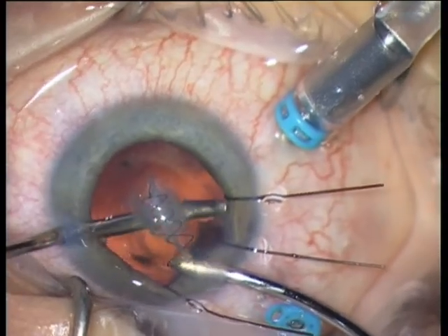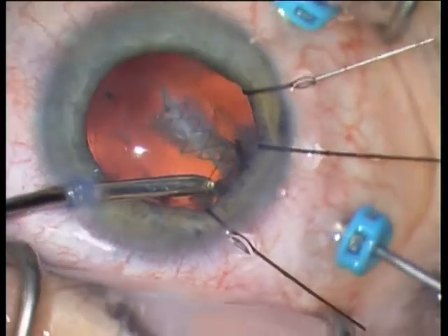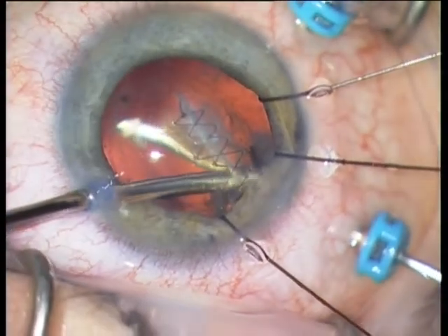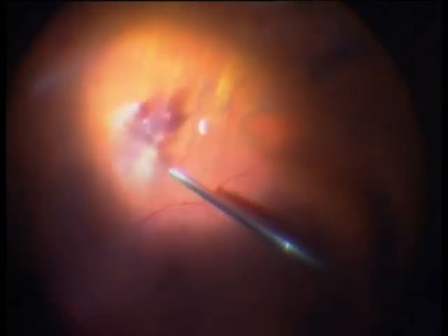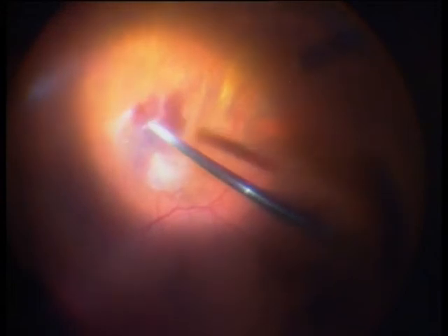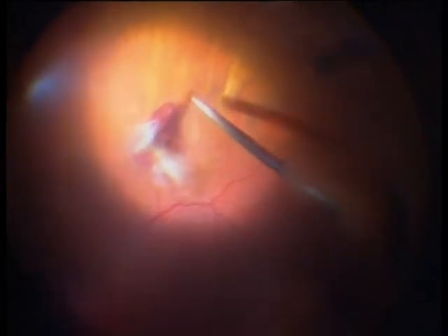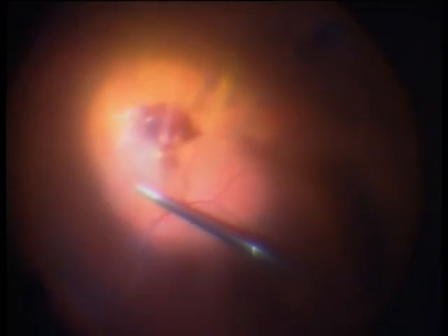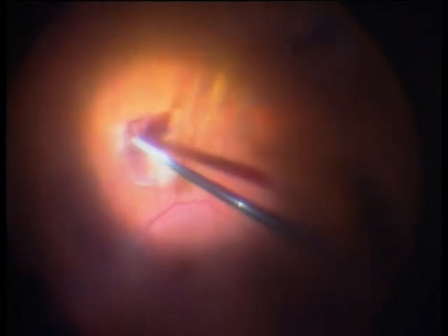My initial plan was actually only to perform a FACO and IOL surgery, and to perform a vitrectomy one or two weeks later. But due to the capsular defect, I was forced to proceed with vitrectomy and continued the whole way through. Usually I would only perform a FACO and wait one or two weeks before continuing with vitrectomy. This funny hemorrhage at 6 o'clock at the height of the equator — I don't know if the eyelash caused it; another theory is that this is a perforation from the intravitreal antibiotics.